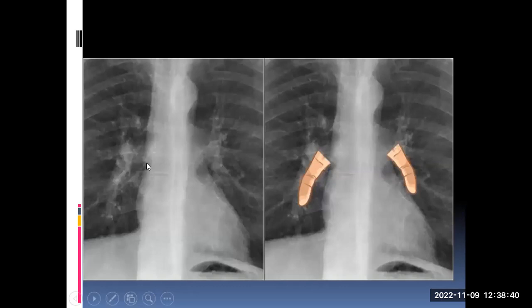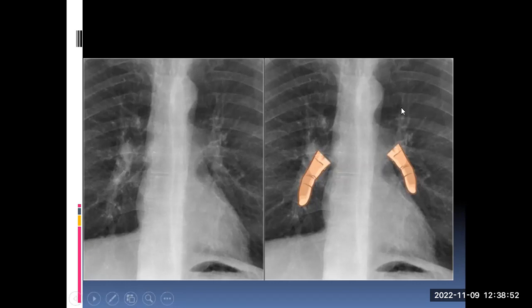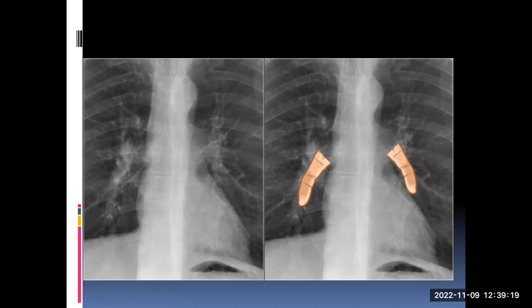Then you look at the hilum. We have simple working rules as radiologists — that is what gets us by every day. The upper part of the hilum is made up by the upper lobe pulmonary veins, and the lower part is made by the lower lobe pulmonary arteries. It has a bay-like, concave appearance. The lower lobe pulmonary artery usually looks like your little finger held out — slightly curved. If the artery appears tubby or abnormally swollen, you know this artery is not quite right. These are simple but very useful things in day-to-day practice.